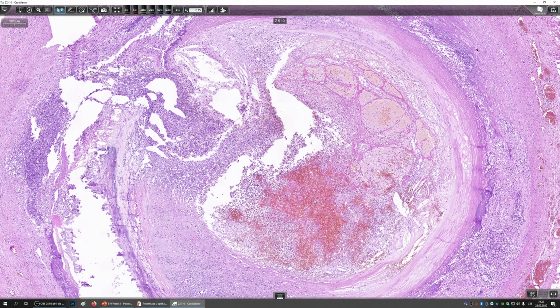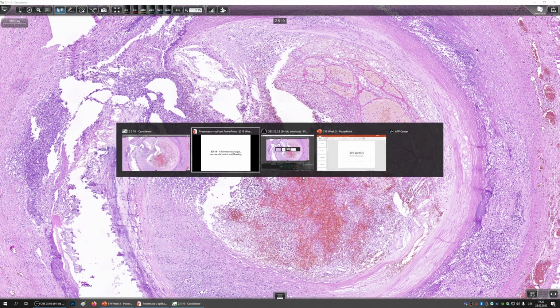Especially prone to unstable atherosclerotic plaques are the coronary arteries, and it can lead to very rapid closure and to heart attacks. Basically, here you see a textbook example of an unstable plaque which has suddenly enlarged due to bleeding into the plaque, and it has caused critical ischemia, which has led to the loss of the limb. And let's check out, I think, the last slide.